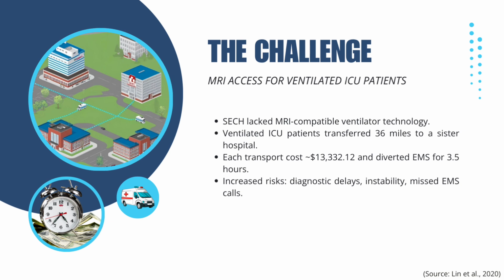It started about a year ago when I discovered the challenge, and this was that the hospital that I work at, St. Elizabeth Community Hospital, lacked an MRI-compatible ventilator. So this required us to transfer our ventilated patients out to one of our sister facilities, which was 36 miles one way. The transfers, of course, as you can imagine, came with significant clinical and logistical drawbacks.